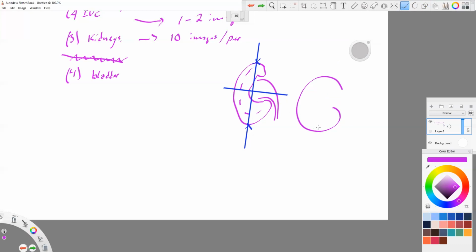It doesn't quite look transverse enough. Let's just make a C. Thickened bubble C, like you guys did when you were kids, your bubble letters. A transverse section of this is now going to look a little different. We're going to measure, I prefer to measure, so this is number 2. This is this plane right here coming across. We're now looking at our view of the kidney as a transverse view.